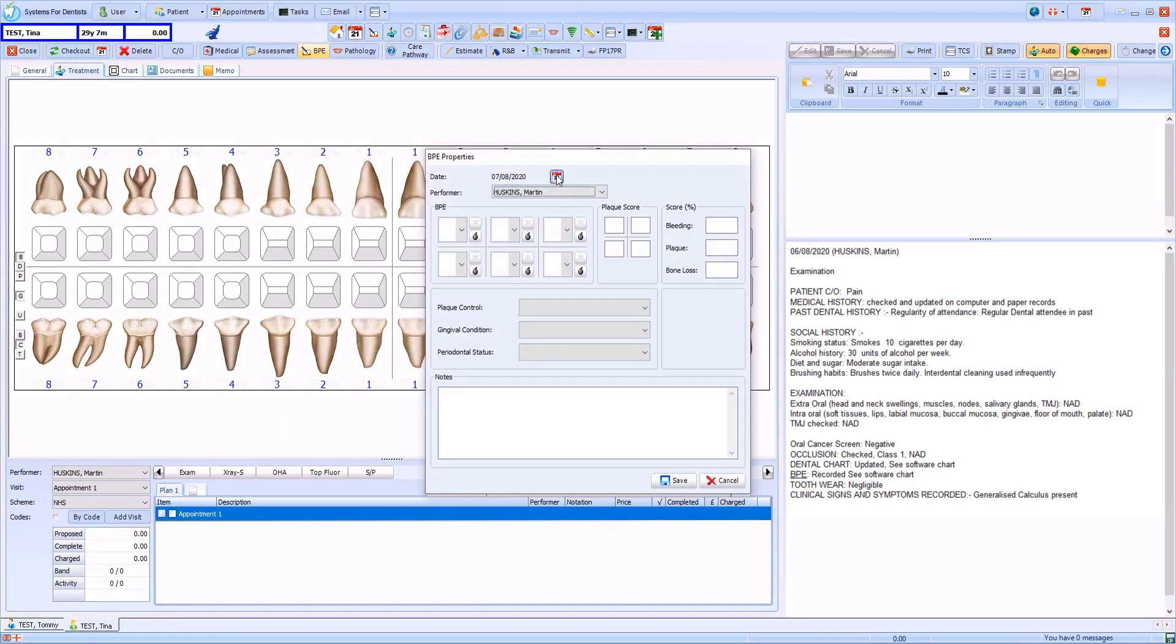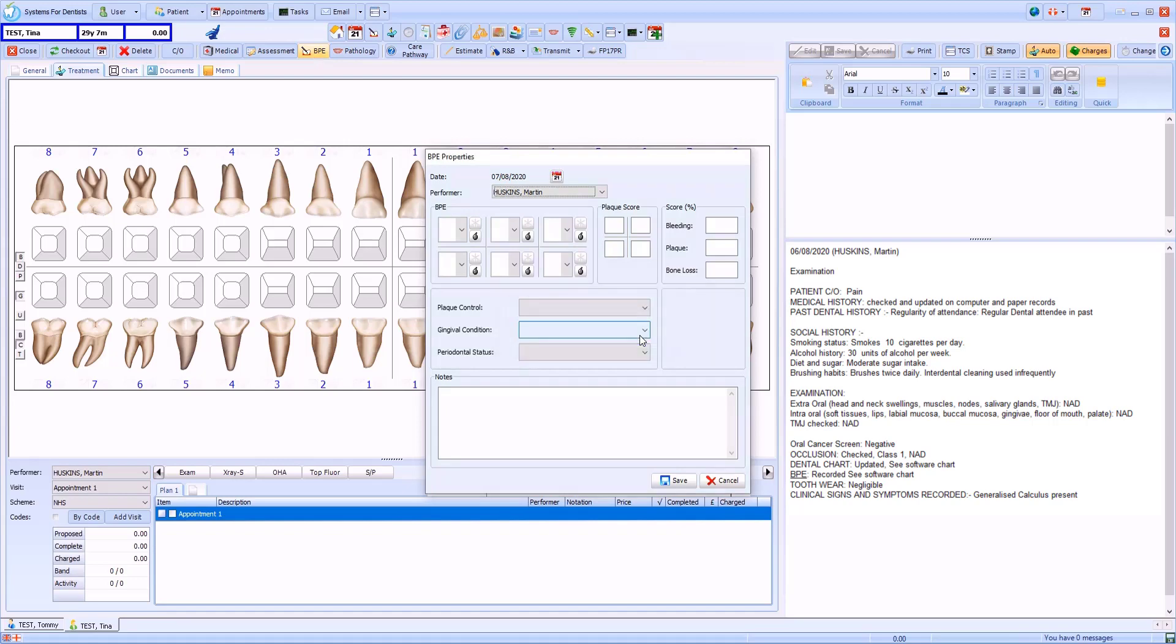The date defaults to today but this can be changed if necessary. You can then enter the relevant codes into the template via the drop downs.